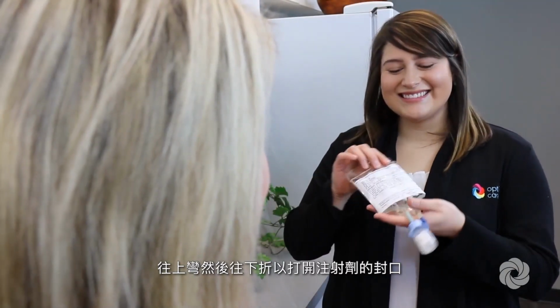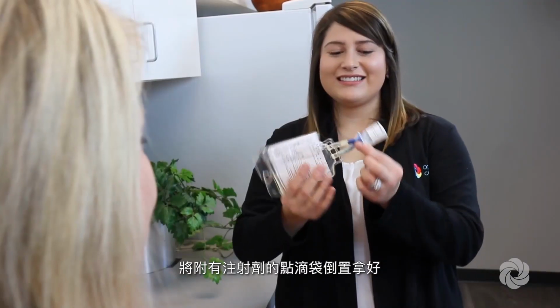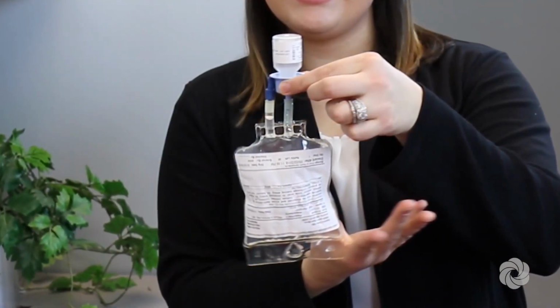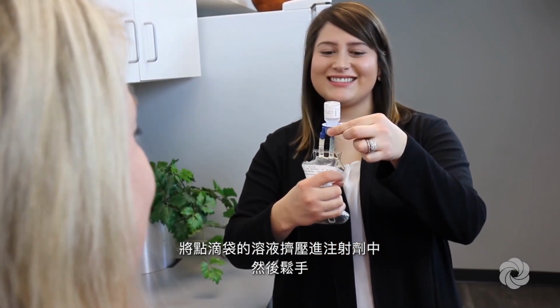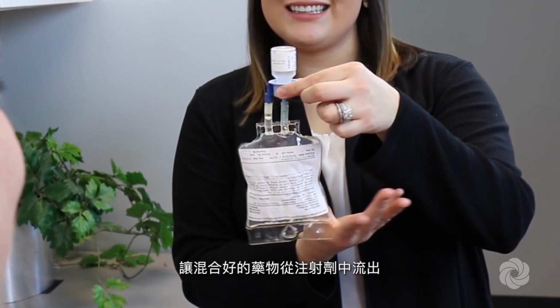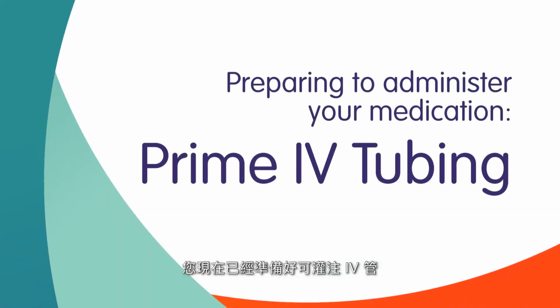Bend up, then down to break the seal of the medication vial. Hold the medication bag with vial upside down. Squeeze the medication bag to force solution into the vial, then release to drain the mixed drug from the vial. Repeat these steps until the vial is completely empty of the drug and solution. You are now ready to prime your IV tubing.